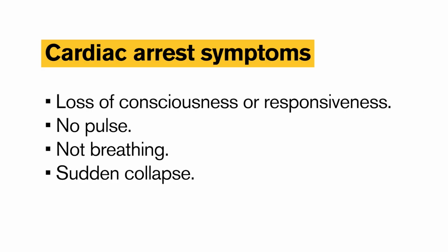This video will discuss cardiac arrest symptoms and how to respond if you encounter a cardiac arrest situation. Sudden cardiac arrest signs are immediate and life-threatening. People who experience cardiac arrest abruptly lose consciousness and have no pulse. Take these steps when responding to a potential cardiac arrest victim.